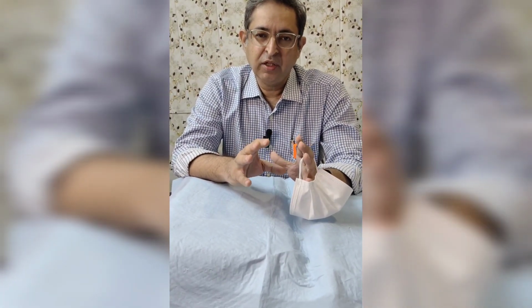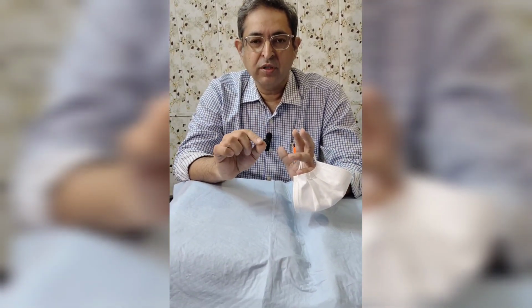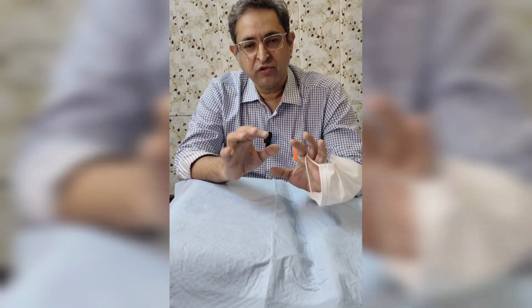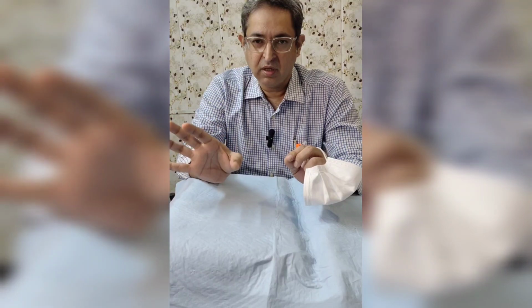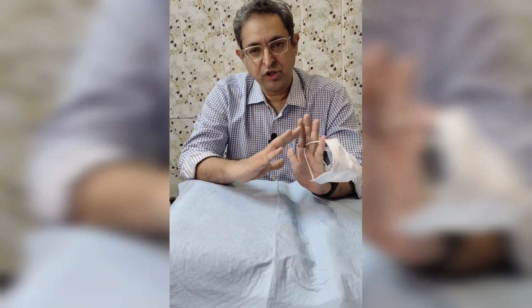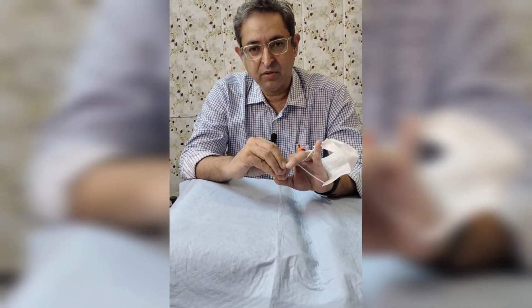First, for the examination of the ear, whether it is a long case or a short case, when you are asked to demonstrate the process of examination to the examiner, you have to see the correct position of the patient, the correct position of the examiner, and the correct position of the bullseye lamp and your head mirror.